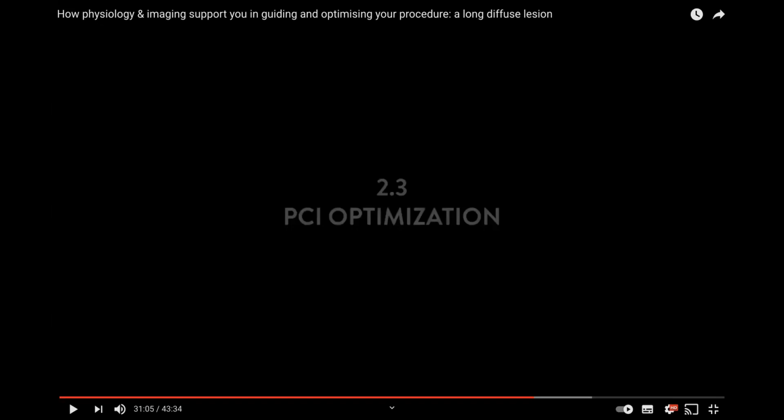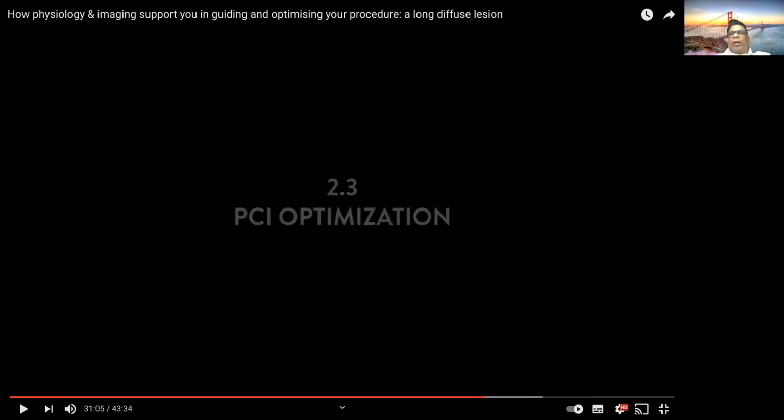Initially, in this case, there was a long lesion in the mid LAD with tight stenosis. CT FFR was very significant, the distal LAD CT FFR was very significant, and the proximal CT FFR was normal.